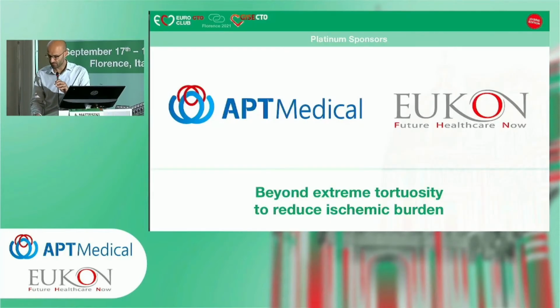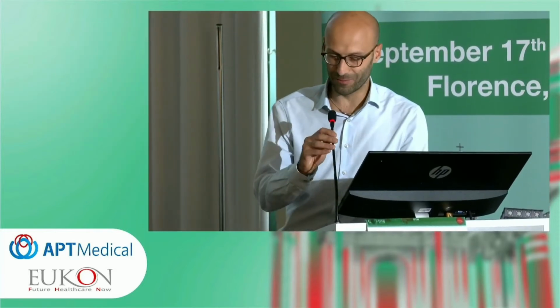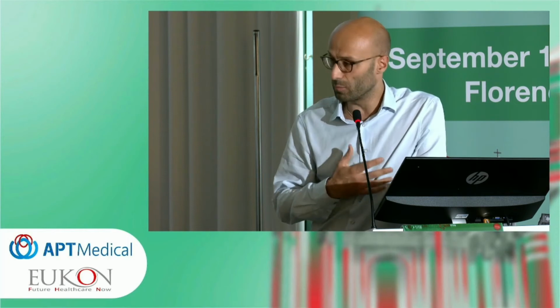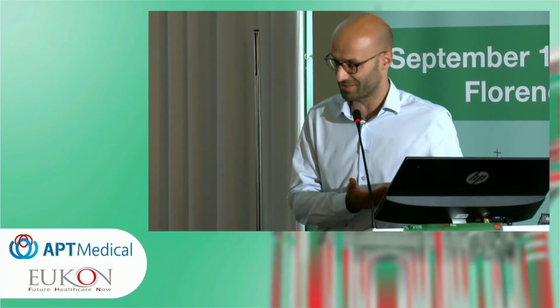So Alessio, we can say that probably the culprit lesion was not the circ. We finally realized that the culprit lesion was not the circ, but this right. But you know, during the day it's easy to cannulate. The patient arrived in the middle of the night in this hospital. Yeah, they did many attempts, and we spent a lot of time in order to cannulate this right coronary artery as well.